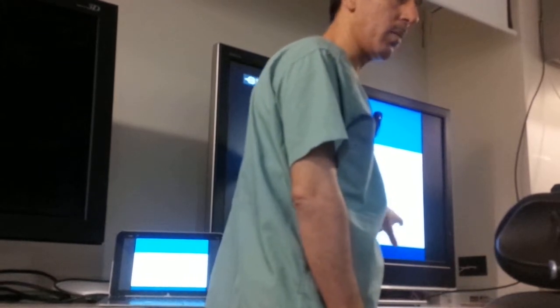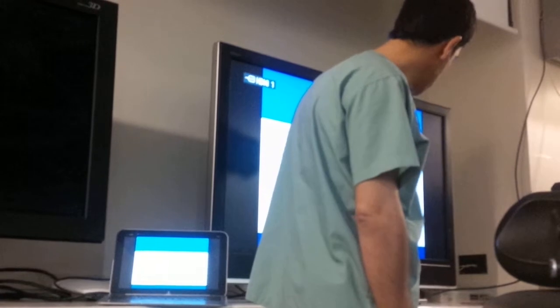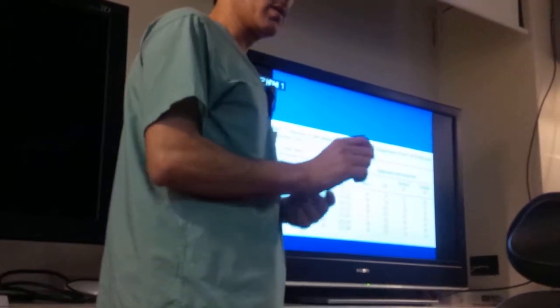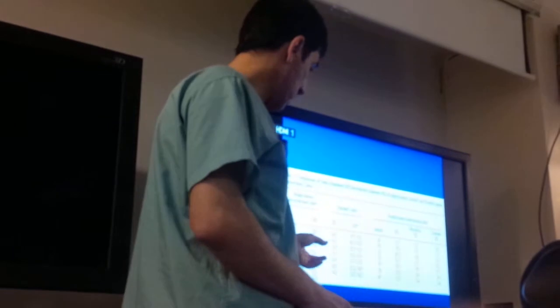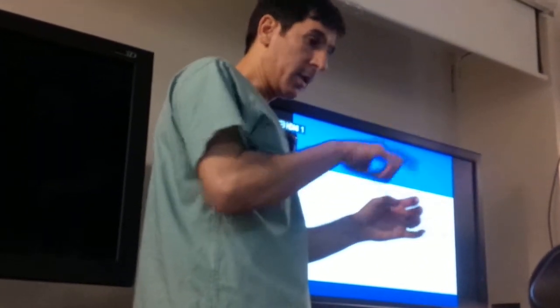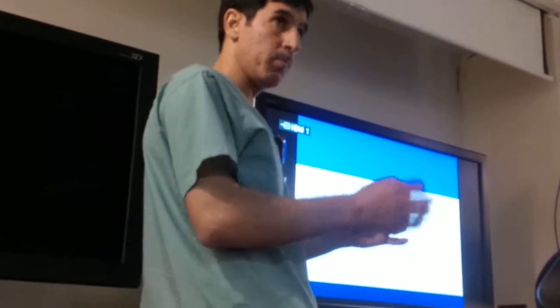Look at the 39, it's 13 millimeters. How much bigger! But look at the inner diameters, we can see that bronchial diameter is 4.9 millimeters. If you go to 37, 4.5, 4.7. So the bronchoscope which you have to use in the double lumen tube is smaller than the one for the single lumen tube, because the inner diameter is small and D-shaped, it's not round.